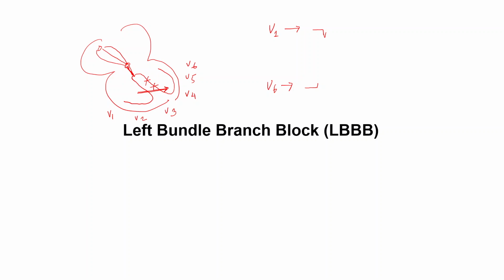Left ventricular depolarization is happening through the ventricular myocytes, so it will be delayed and slowed. So the second wave in V1 will be a negative wave, of course. In V1 it will be a negative wave because the depolarization is opposite to that of V1.